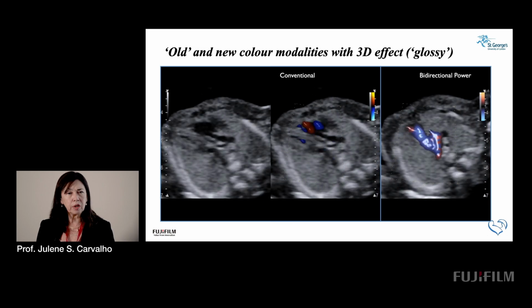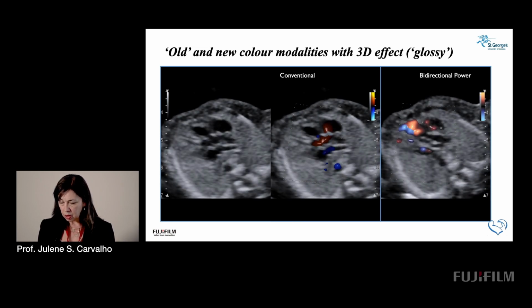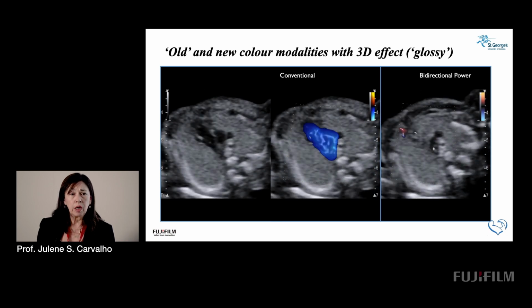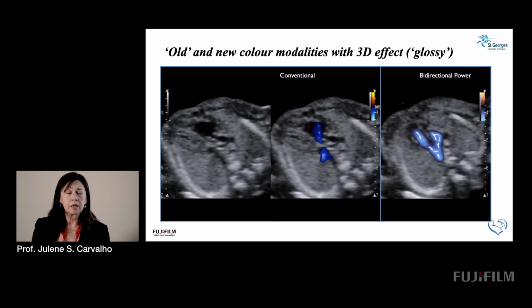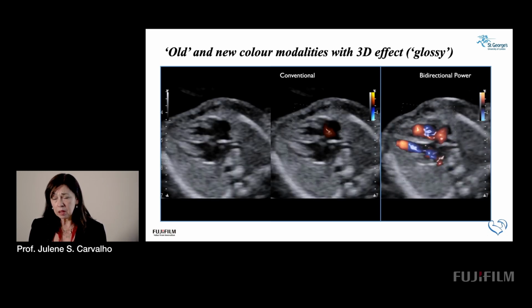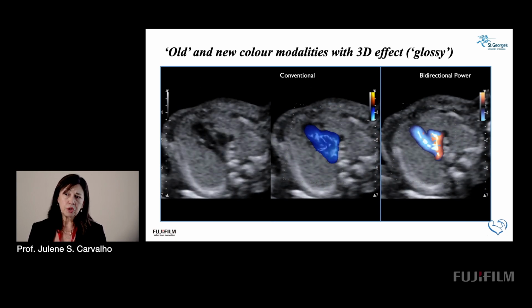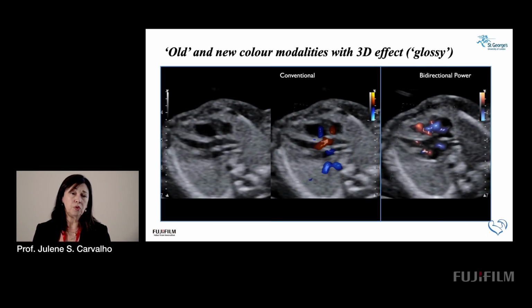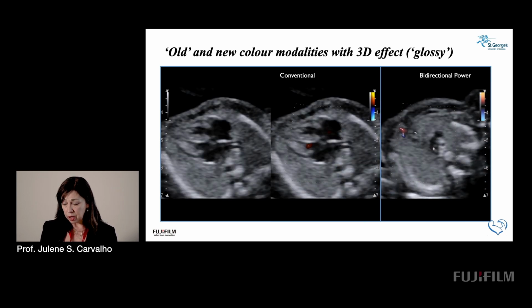But as you're doing it live, you know what kind of velocities you have set the system for. So this can be very useful, and they give different information. The power Doppler is less angle dependent, and it's more sensitive for small vessels. So you just need to get used to the different modalities available on whatever system you're using.